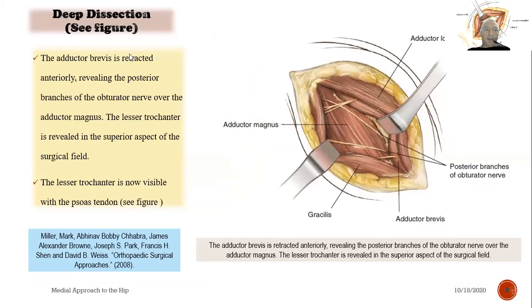Deep dissection continued: the adductor brevis is retracted anteriorly, revealing the posterior branches of the obturator nerve over the adductor magnus. The lesser trochanter is revealed in the superior aspect of the surgical field and is now visible.